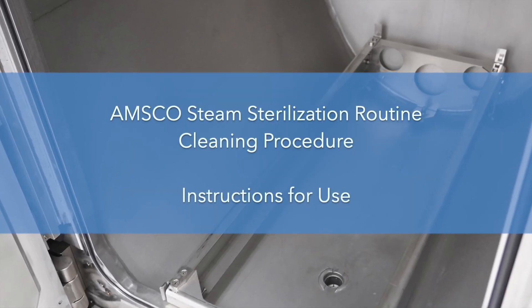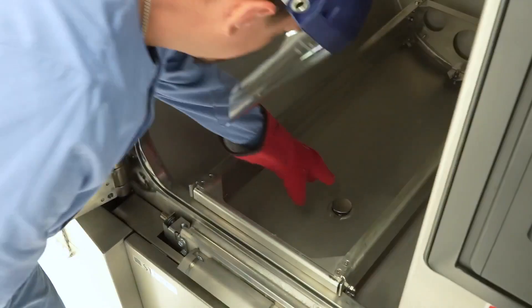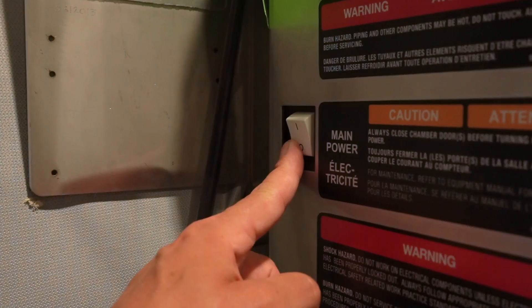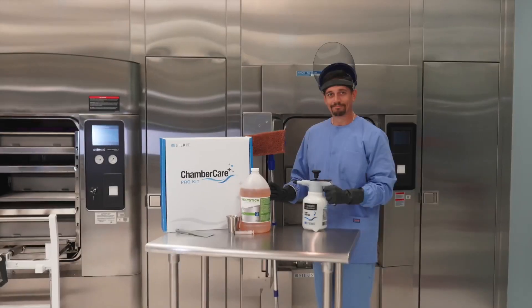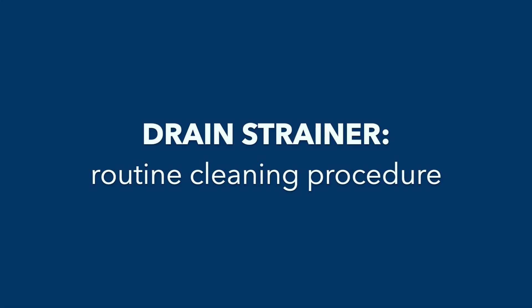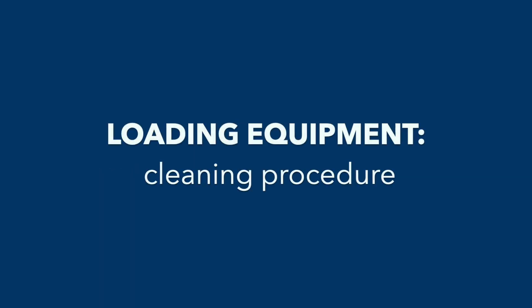Welcome to the AMSCO Steam Sterilization Routine Cleaning Procedure Instructions for Use video. In this video, we will cover general information, materials required, safety considerations, drain strainer routine cleaning procedure, drain routine cleaning procedure, chamber routine cleaning procedure, and loading equipment cleaning procedure.